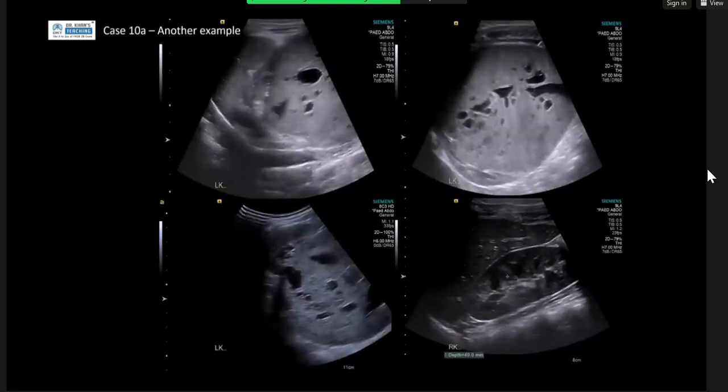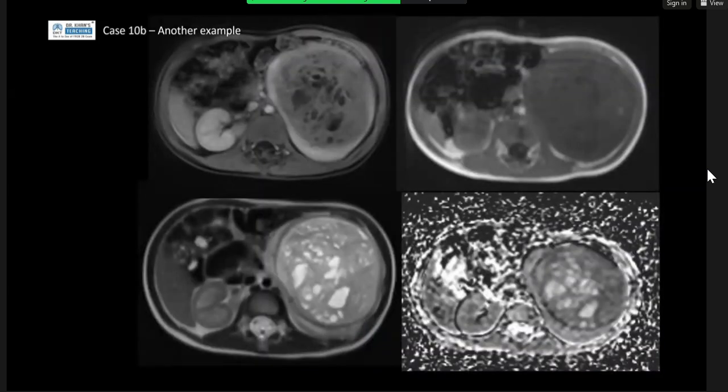So just another example of Wilms as well, okay, on ultrasound, and then following that, so you get this mixed cystic solid mass. You probably would wonder, where's it coming from here? Is this a claw sign from the renal tissue? And then at the other side, a left kidney and a right kidney looks normal. And you see here nicely this claw sign from the renal parenchyma on these images.